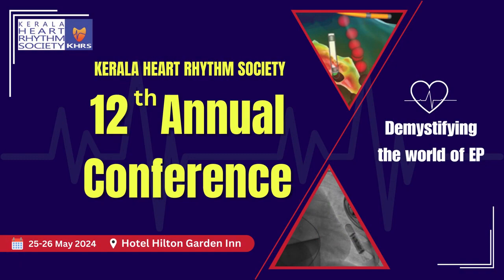I think the trial was done with the intention that a lot of physicians are still more used to the catheter-based point-by-point technique, RF ablation, quite a few people other than the cryo users. So this may be an easy transition for them, and I'm not surprised that it is less likely that we are going to be using this technique when it comes to choosing between RF and PFA.